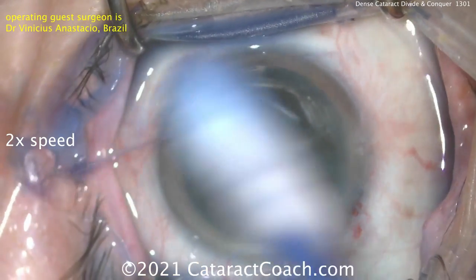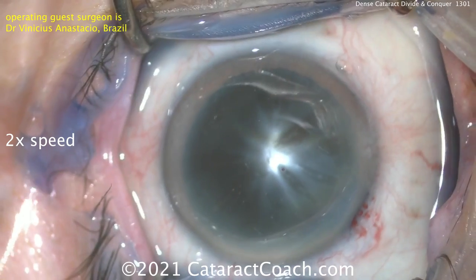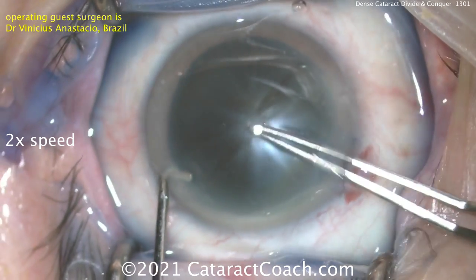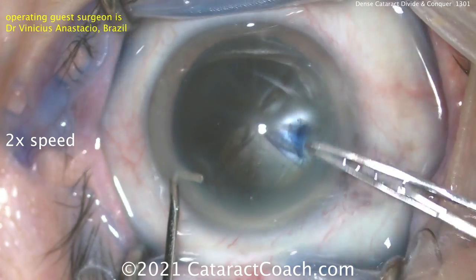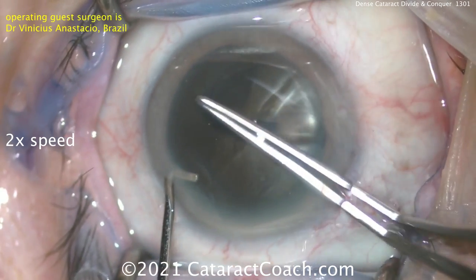Someone asked me: you always talk about phaco chop and quick chop and vertical chop and combo chop — can I just do divide and conquer? Of course, you do what's best in your hands. And if you like divide and conquer, it's a very appropriate technique. You're welcome to just do divide and conquer your entire career and do beautiful surgery with great results.